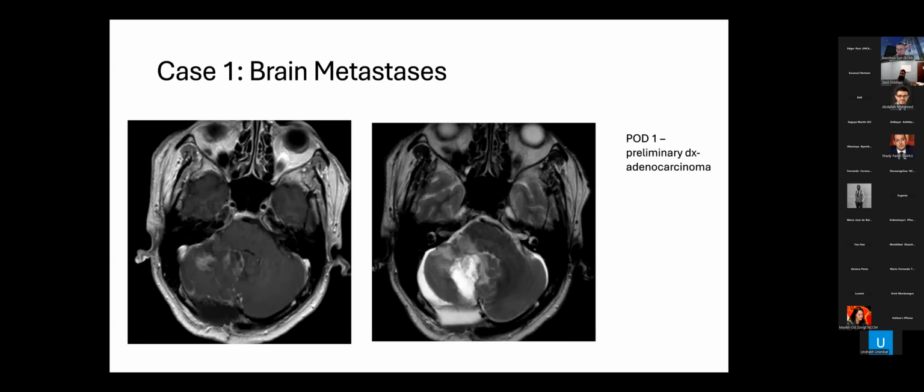Number one, the cavity is very dynamic after a brain surgery. In the first few days, that cavity shape will change very quickly. So especially with the LINAC-based approach that we're talking about today, which may take a couple of days to plan, if you start to plan the case within a couple of days of the surgery, by the time you deliver the plan, the cavity shape may be different.